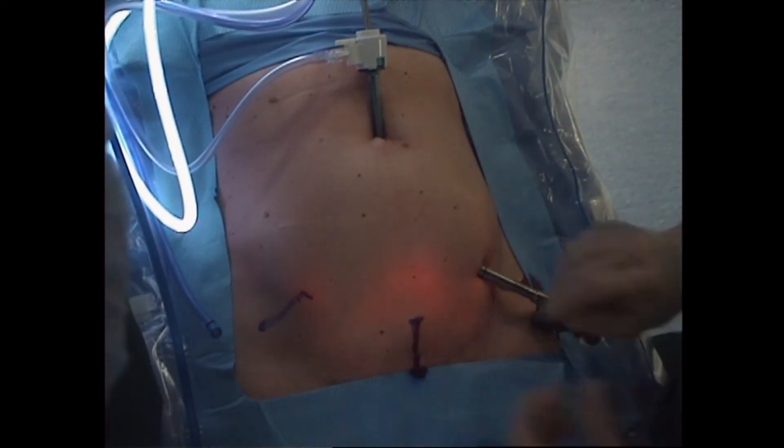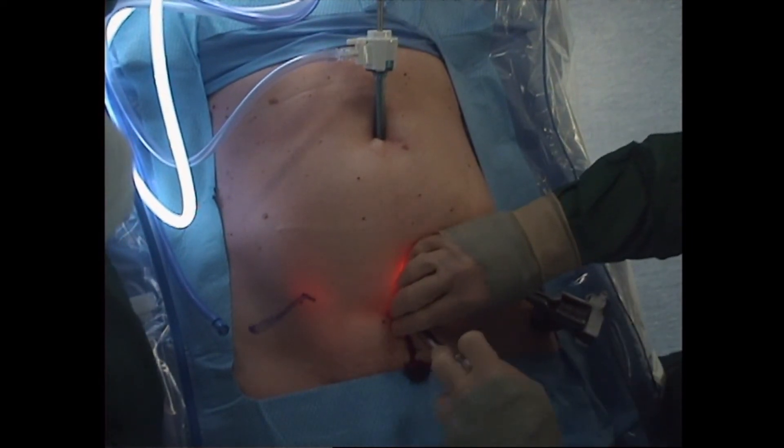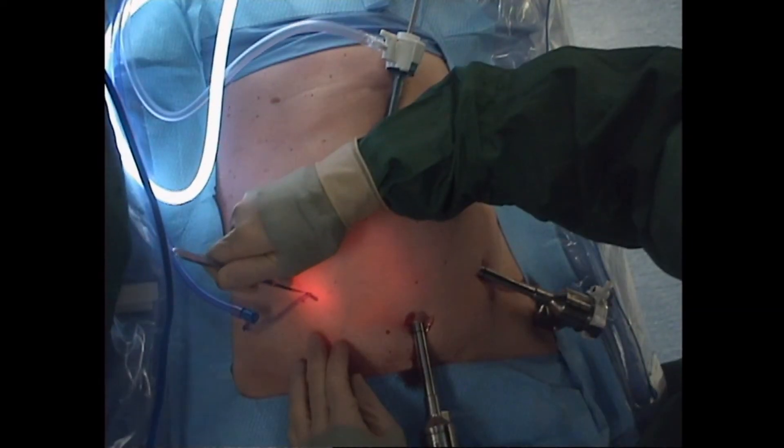The bed is then placed in 18 degrees of reverse Trendelenburg and flexed 10 degrees to make room for the robot arms overlying the thighs.